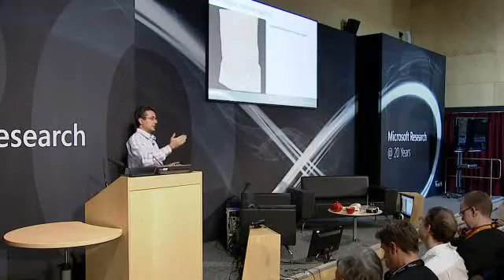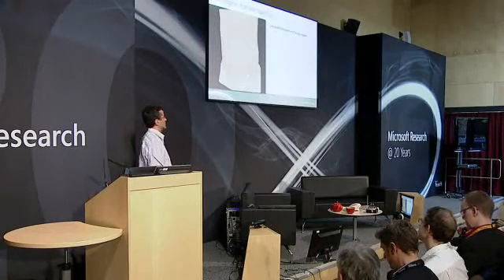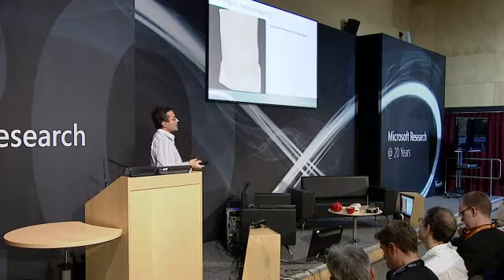How does all this work? Again, by using the power of data. Imagine a CT scan, with a different 3D visualization, which is made non-transparent, so we look at it from the outside. What we want to do is automatically interpret what's inside, where the different organs are. Perhaps even segment, delineate the organ and separate each organ from the neighboring organs. But how can we ever do that?